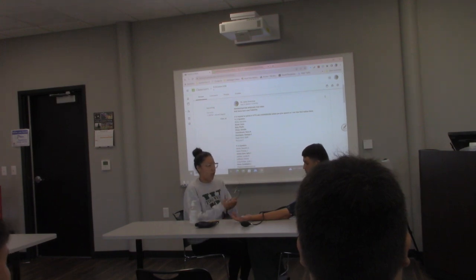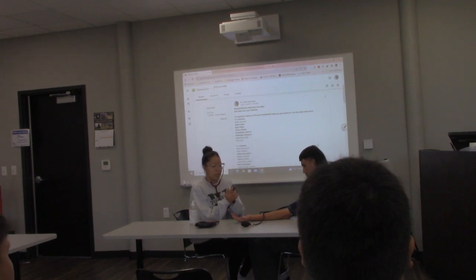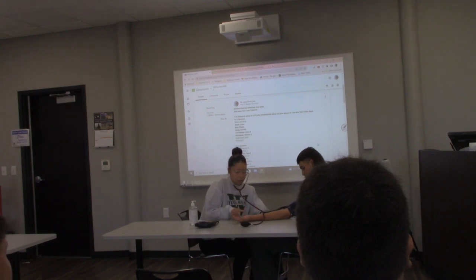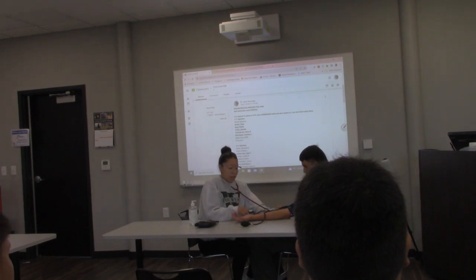Take your stethoscope, place the earpieces in, and place the diaphragm right here on the brachial artery. You don't want to press it too hard, otherwise you'll disrupt the reading. Watch the gauge and listen. Since I estimated 100, I'm going to add 30 and pump it up to 130, then slowly release the pressure.